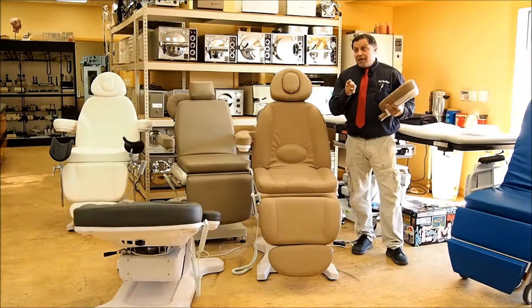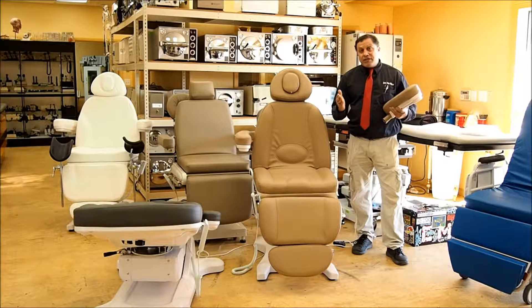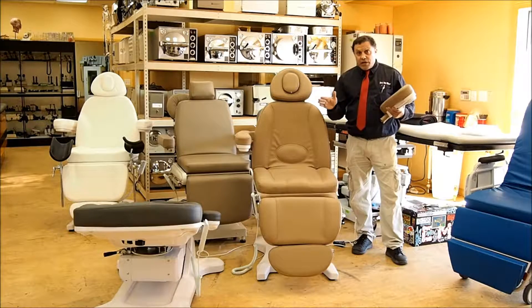Also, don't be confused — there's a lot of chairs out there that look similar to these, but they don't have the same warranty and they're not the same manufacturer. These are the DTS Premium programmable tables, swivel chairs, and there are some stationary chairs too.